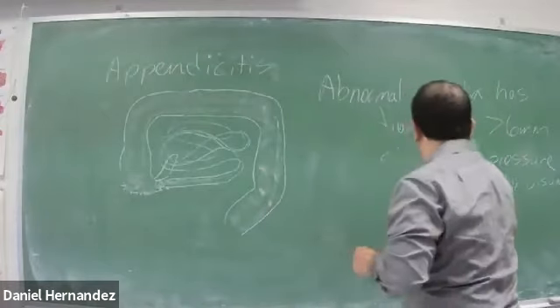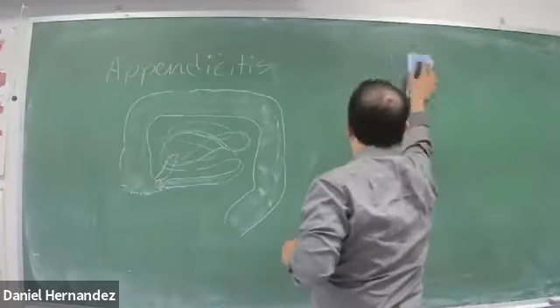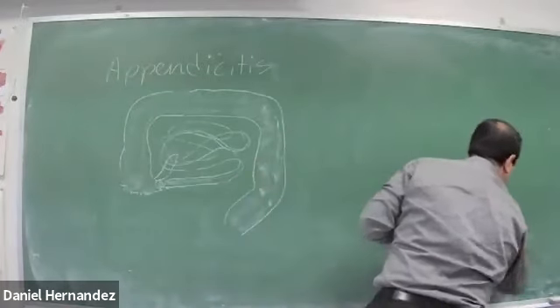For imaging, we're going to use a high-frequency linear probe.